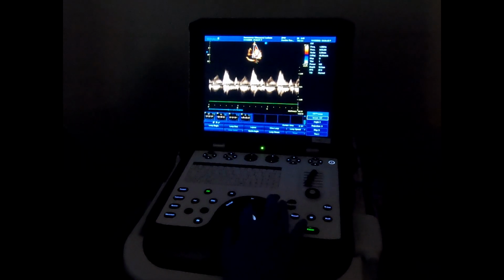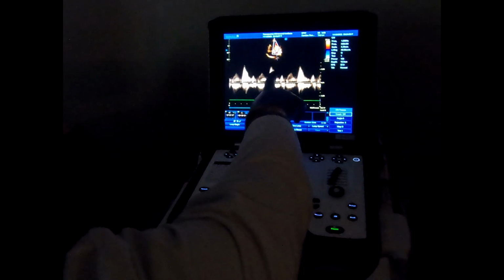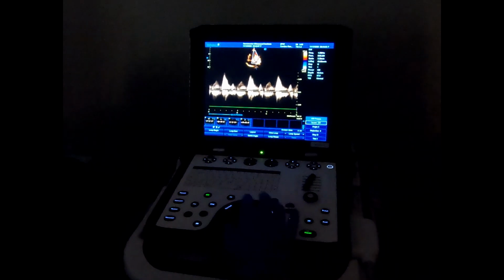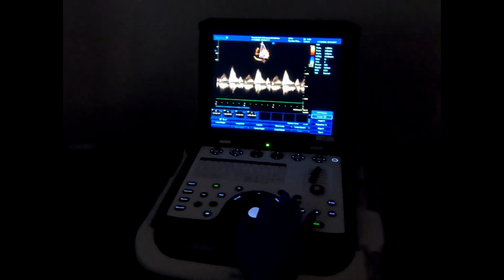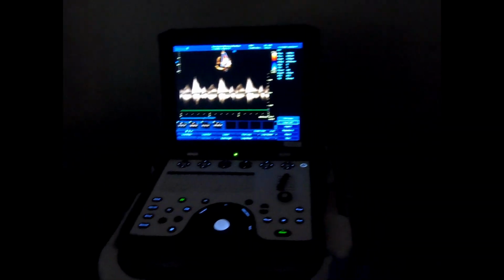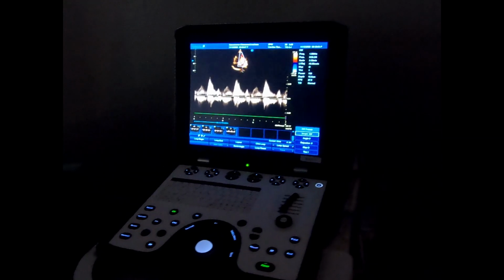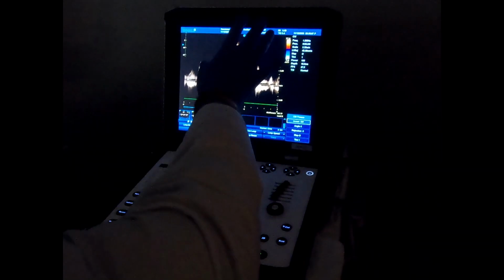The one that's in the middle. Okay, now it's to the left. It has a chunk taken out of it. No, to the left. That's the steepest one. Why wouldn't that be good? Because that chunk is out. Well, even this chunk is not real. You see, it's an artifact. I know you don't have that visual understanding now, but the actual peak is.